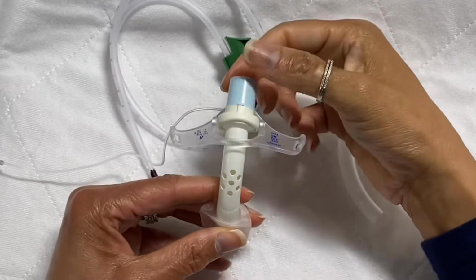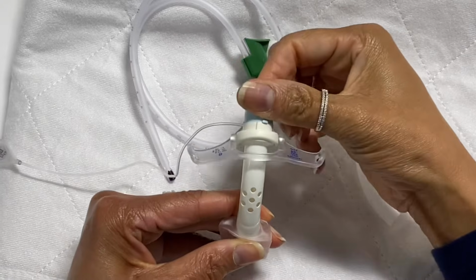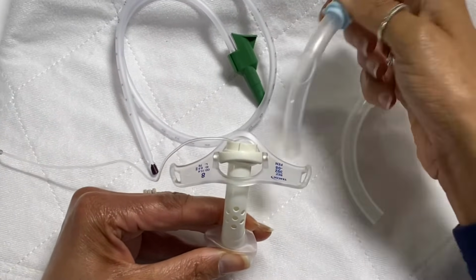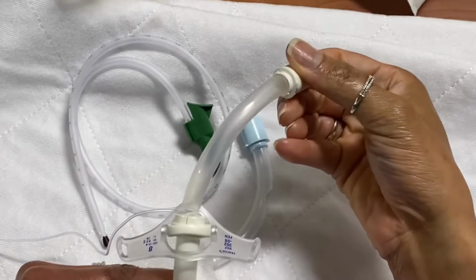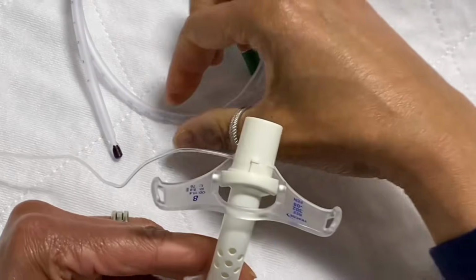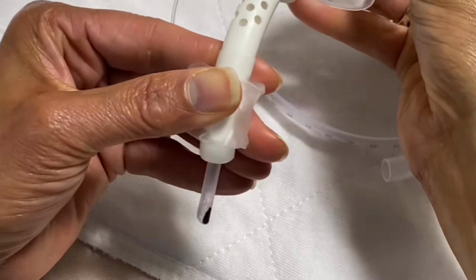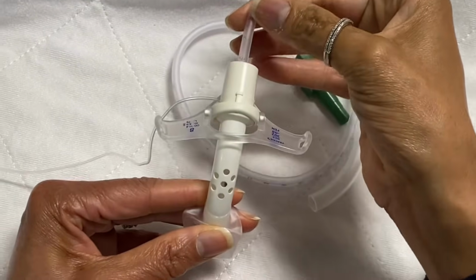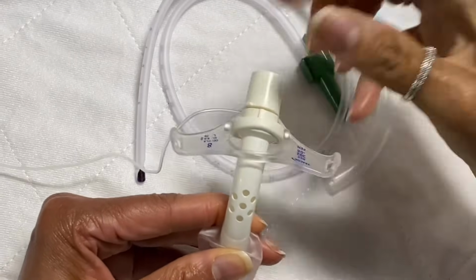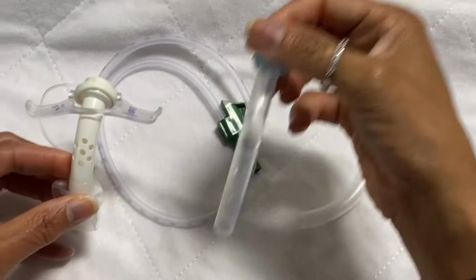If you're uncomfortable with suctioning your patient with the fenestrated inner cannula with the lumen inside, then you can twist the top and just remove the inner cannula, and you can replace the inner cannula with the non-fenestrated, and you just lock it into place, and then you can easily glide the catheter through the trach. Once you're done suctioning your patient, you twist, remove the inner cannula, and you're going to replace it with the fenestrated inner cannula.